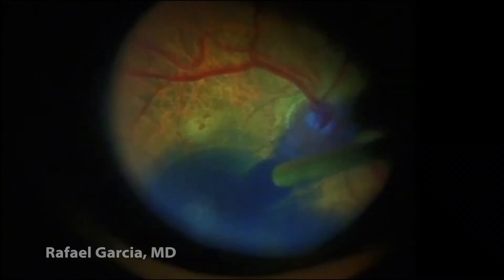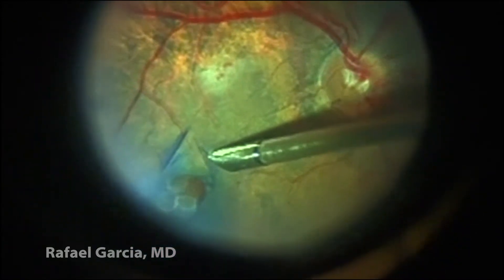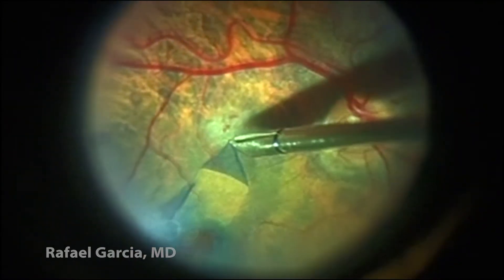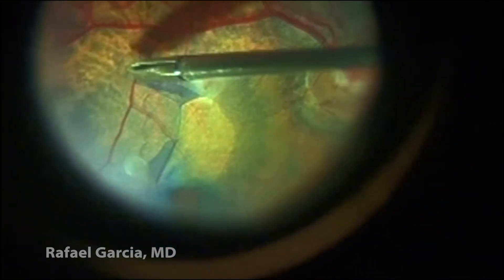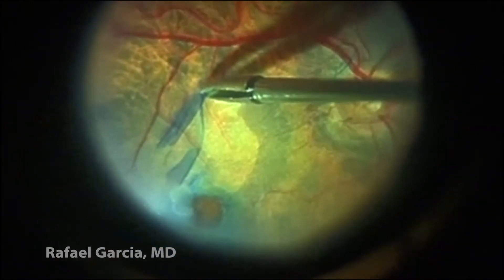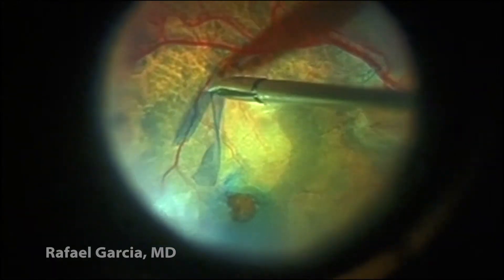After that, brilliant blue dye is utilized once again. Now we can actually see a flap of the ILM in the superior border of the hole. The peeling is once again made in a circumferential manner, just like we would in a routine capsulorhexis.